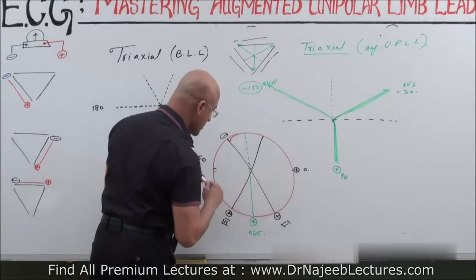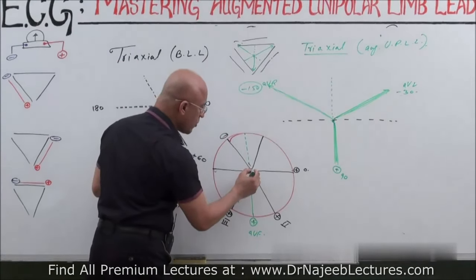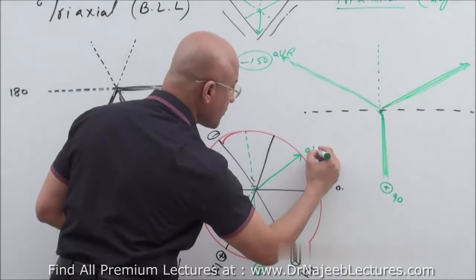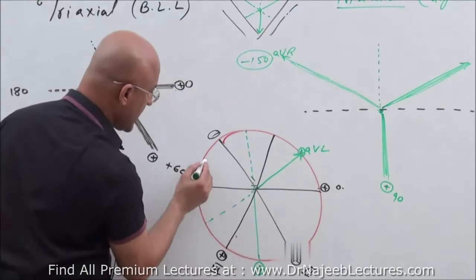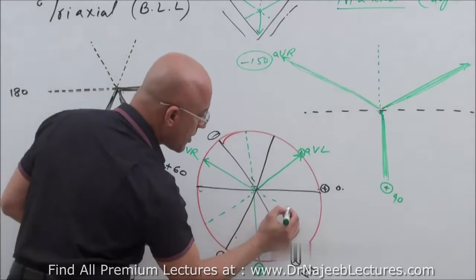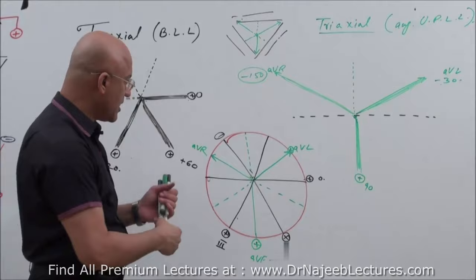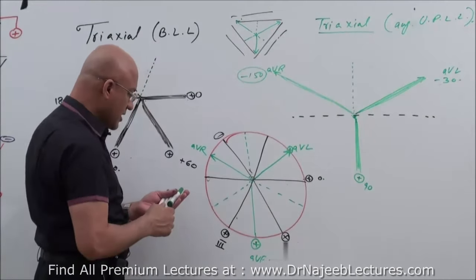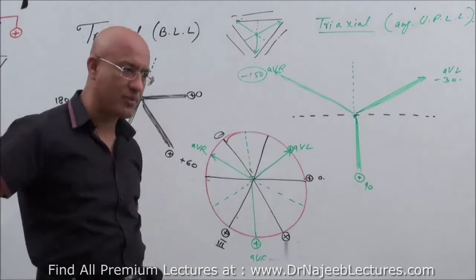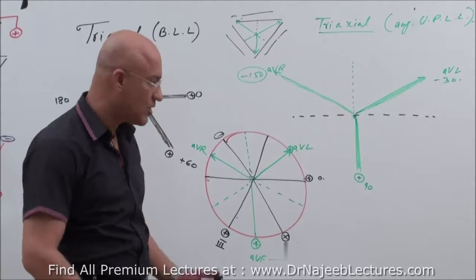Any question up to this? There's no question. Now, what was this lead? AVL. Positive was here. And there was a positive here. You know this one, AVR. Now, negative poles, I've made with dashed or dotted lines. Right? Now, how are these oriented to each other? Actually, the same electrodes on the right arm, left arm, and left foot are arranged a different way, and you ended up with how many leads? Six. 6 leads, right?